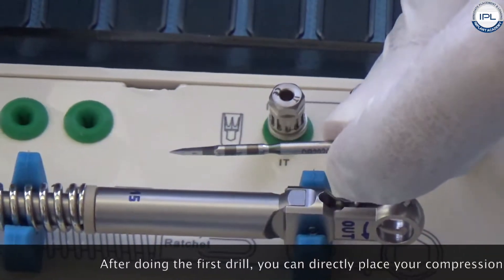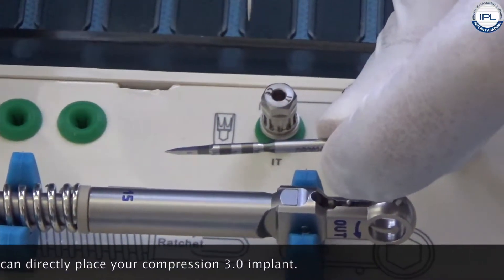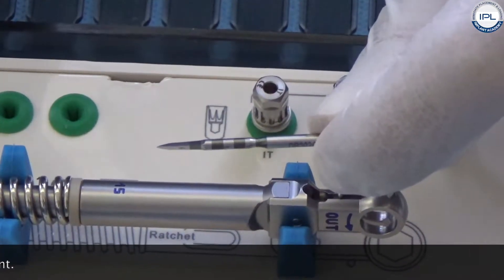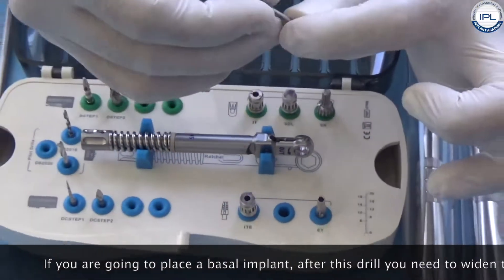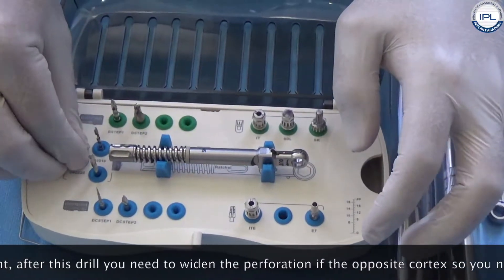After doing this drill you can directly place your compression 3.0 implant. If you are going to place a basal implant, after this drill you need to widen the perforation in the opposing cortex.